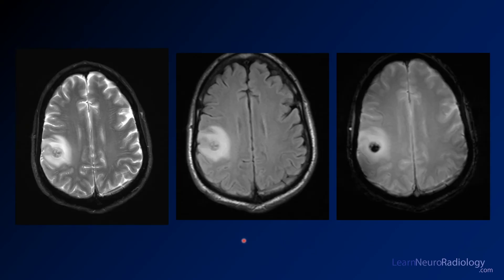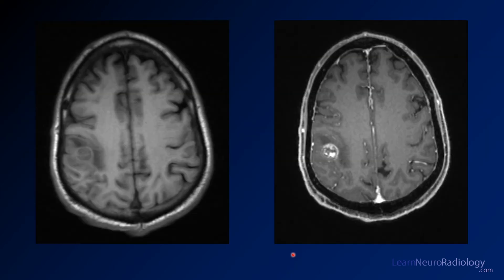Here you see a T2 FLAIR and gradient image. There is some hemorrhage centrally within this lesion, some surrounding edema, and it's centrally isointense to slightly hypointense on T2. On the pre and post contrast images, you see a very irregular pattern of enhancement — it's not solid and doesn't have a regular margin. Those are features that might make you think of glioblastoma over metastatic disease.